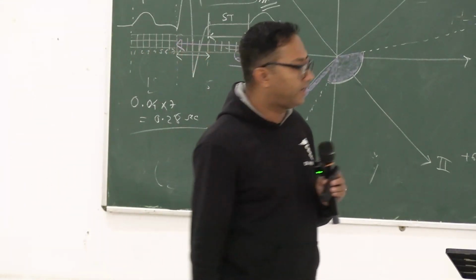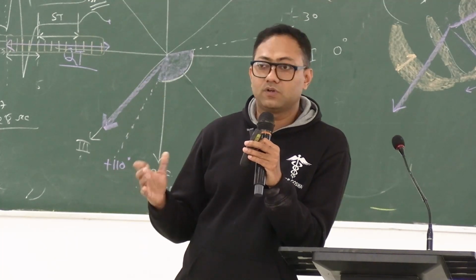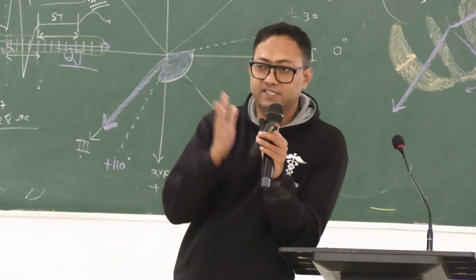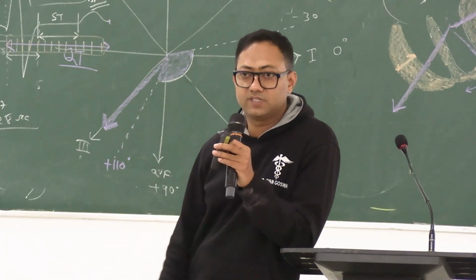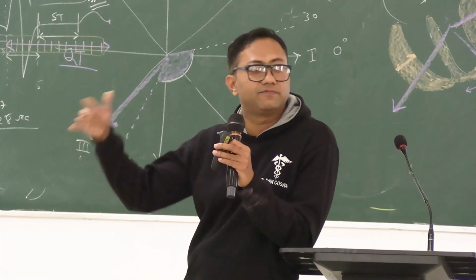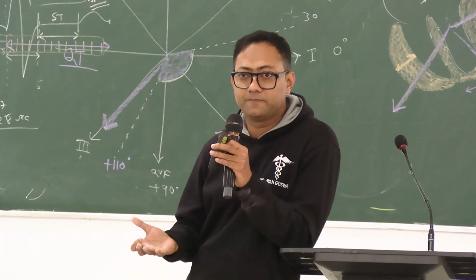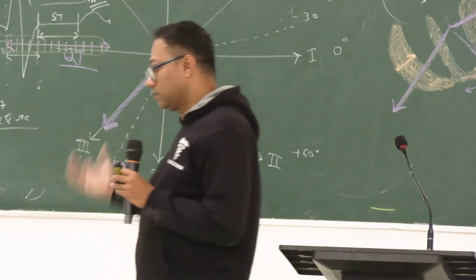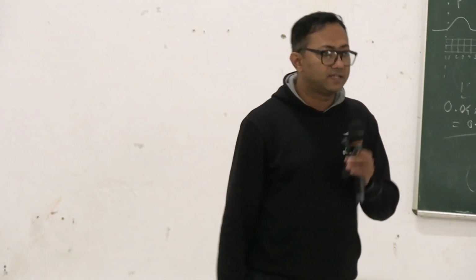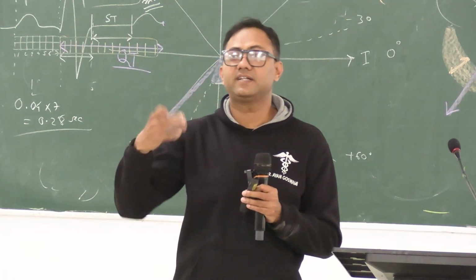Everything is in milliseconds, okay? You also need to remember there is no fixed QT interval, there is a range: 360 to 450 milliseconds for the QTc. If it is, for example, beyond 500 milliseconds, then it is definitely abnormal. There are many causes of long QT, and mostly these are different channelopathies. What are channelopathies? Channelopathies are defects in the ion channels.